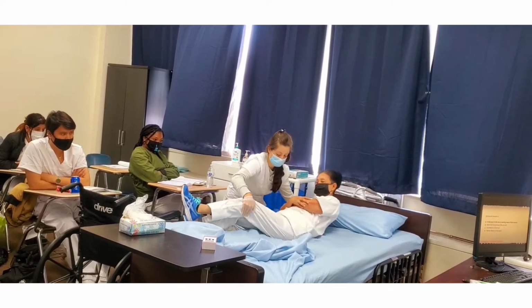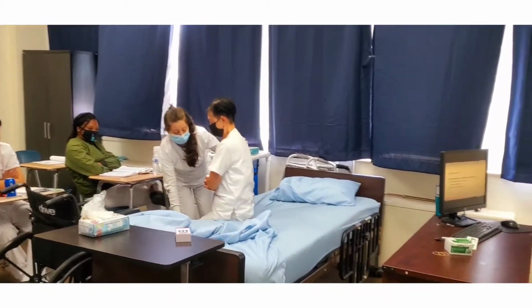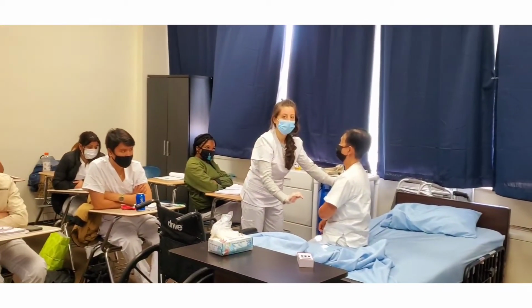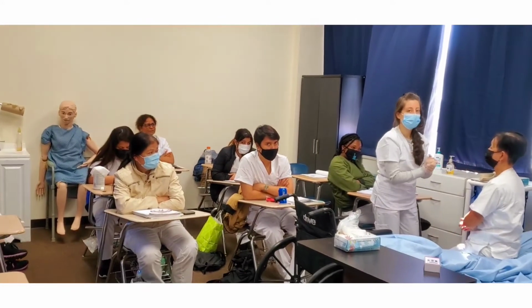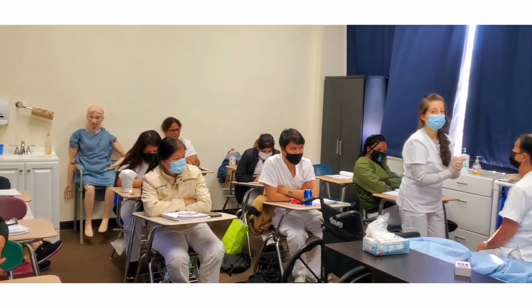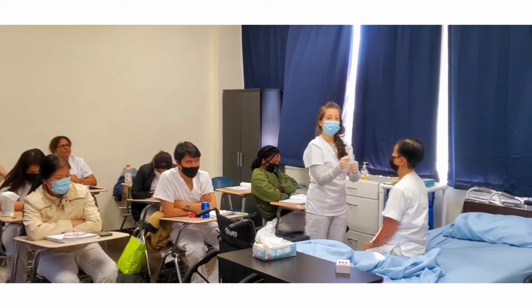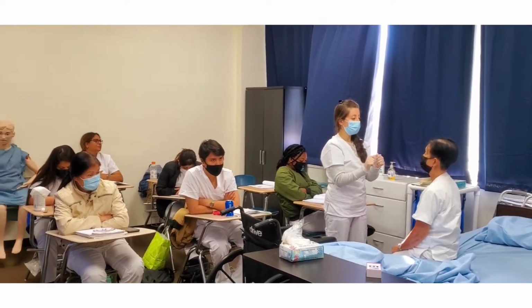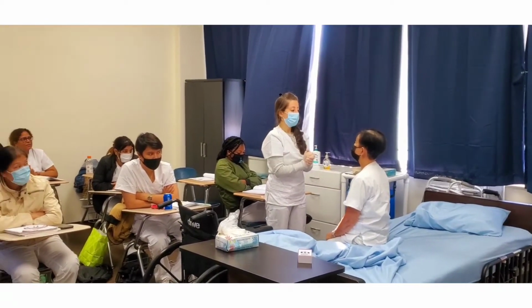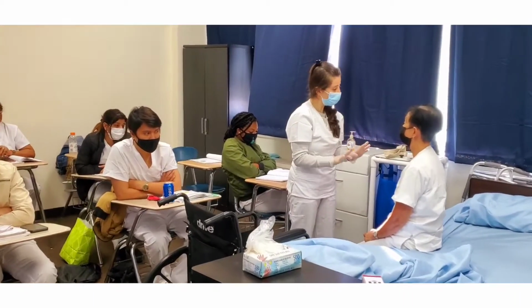So I'm going to pretend. One, two, three. Good job. Are you okay? You should be asking her, are you feeling dizzy? Any lightheadedness? Because your blood pressure drops from a lying to a sitting position, and that's called orthostatic hypotension. So ask your patient if she's dizzy or lightheaded. If so, you have to lay her back down and check her blood pressure. Are you feeling dizzy or lightheaded right now? No. So you're okay to walk?